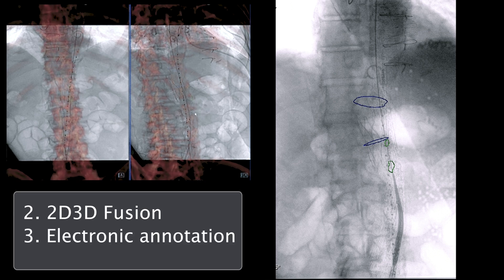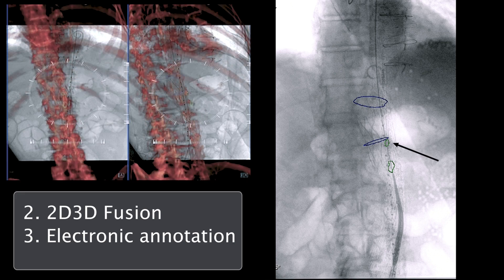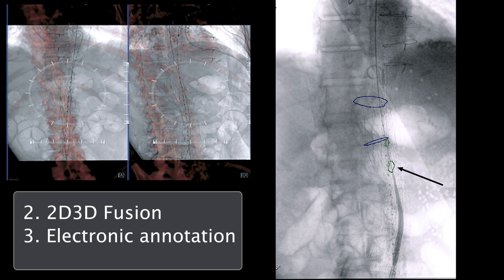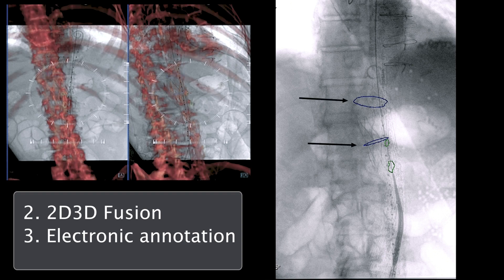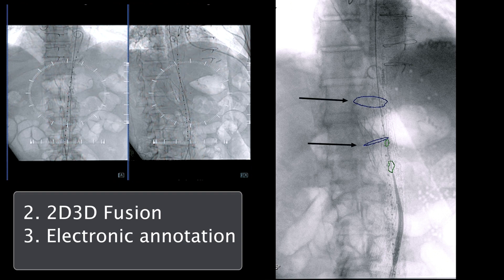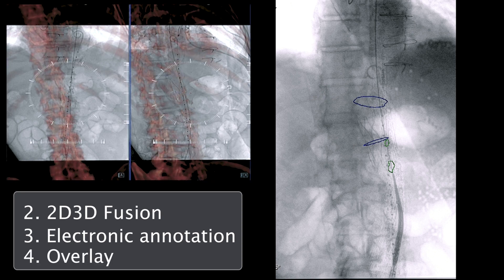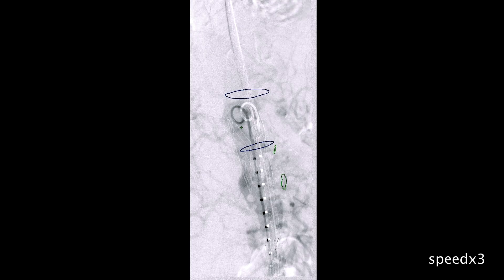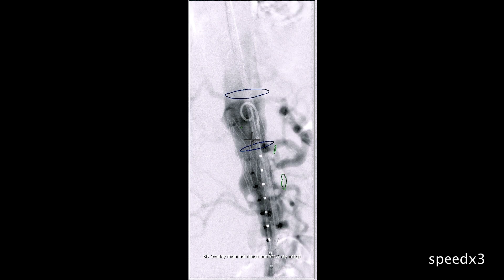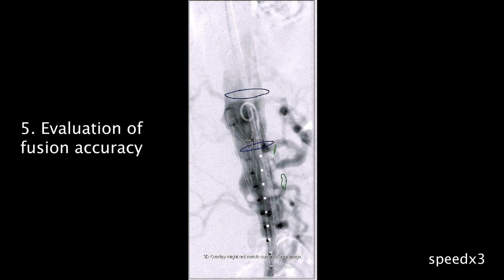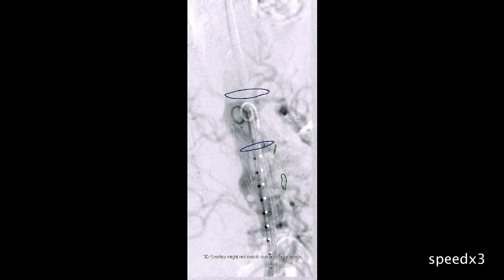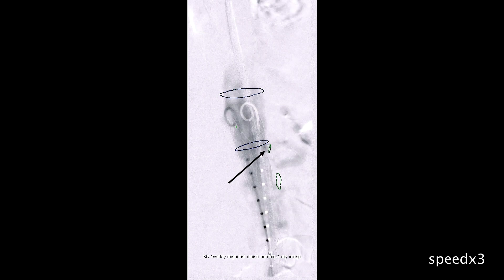Next, we electronically annotated the origin of the celiac trunk and the SMA, as well as the proximal and distal borders of the corresponding landing zones. The annotations were overlaid to the live fluoroscopic image. To confirm accurate representation of the celiac artery and the SMA origin, we performed an aortogram which showed the overlay was slightly off, so we adjusted the mask which now represents the origin of the celiac artery and the SMA.